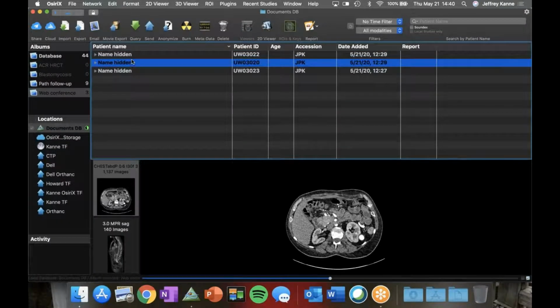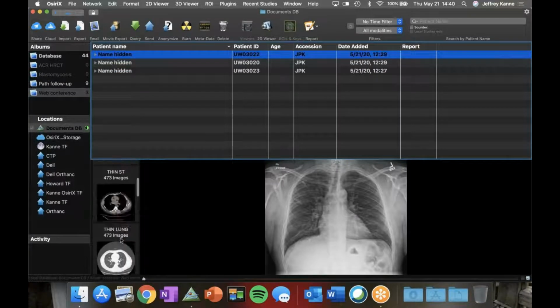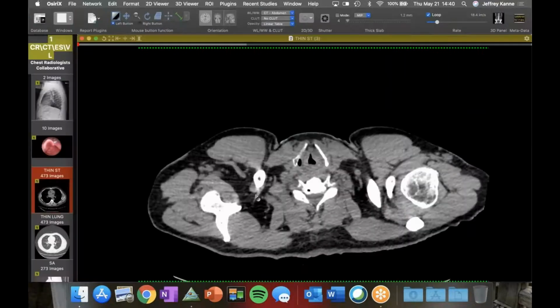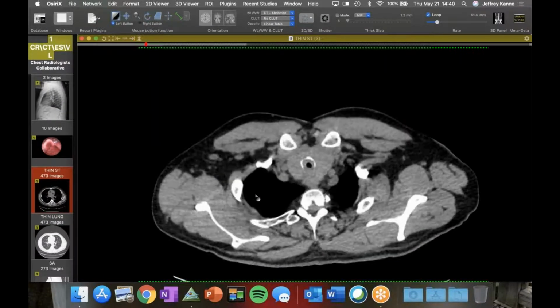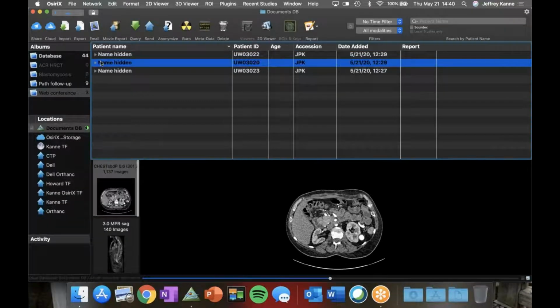Jeff, did I also see the thyroid just? Yeah, the thyroid's really big, enlarged, but otherwise not related to that. As far as I know, it's just a goiter. It's just a goiter. That wouldn't explain the wall thickening. But yes, good point, Howard.